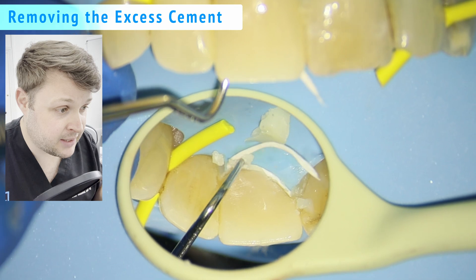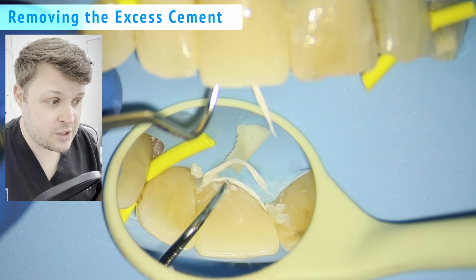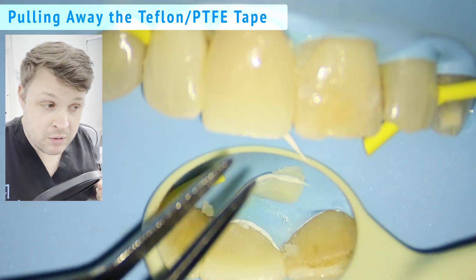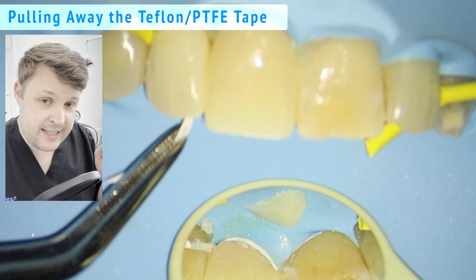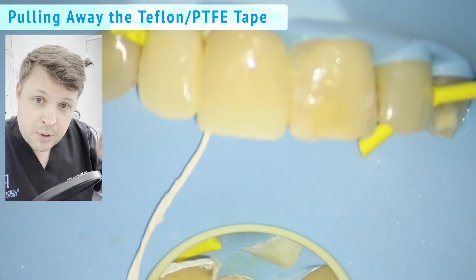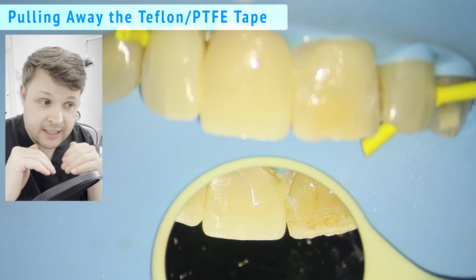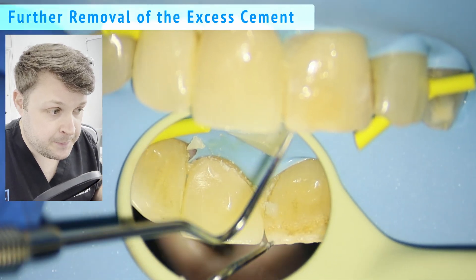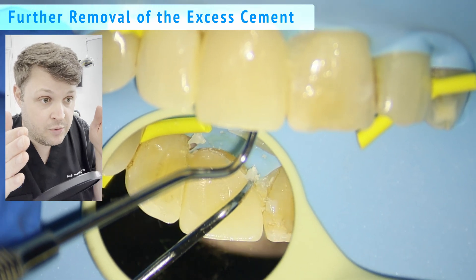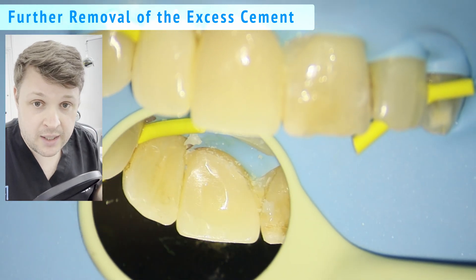This is the point where you see why I use PTFE or Teflon tape around the gingival margin — I'm now pulling it away. It doesn't stick to the cement, so it protects the margin, and because it doesn't stick you can pull it away nice and easily. If you used retraction cord, it would get into all the little nooks and crannies and you wouldn't be able to pull it away. This also helps clean up the margin, though you'll still need to clean up the interproximal area and floss.